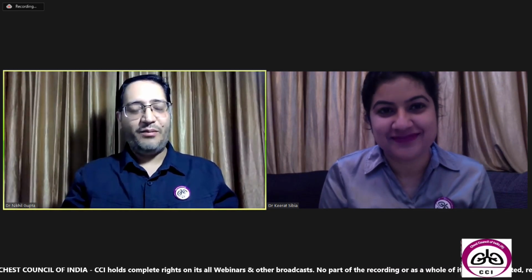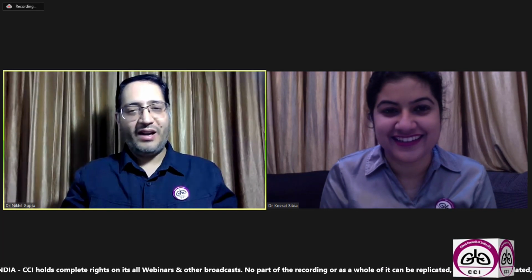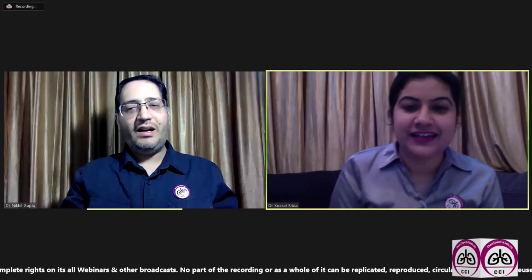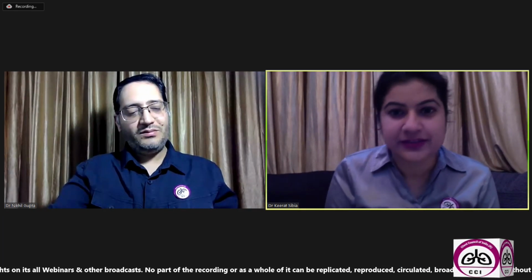I hope you will not take it personally when you are referring to fat over and over again, Dr. Nikhil. Yeah, it is pericardial, epicardial fat. That is what I'm referring to, or subdiaphragmatic, supradiaphragmatic fat. Thank you. And I like how you refer to, please carry on. Hiatus hernias, basically hiatus hernias.